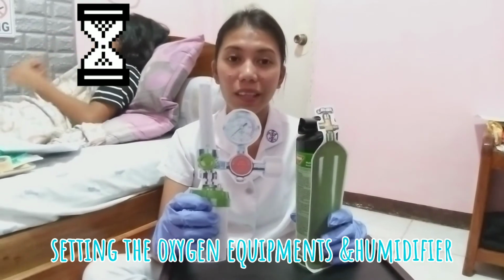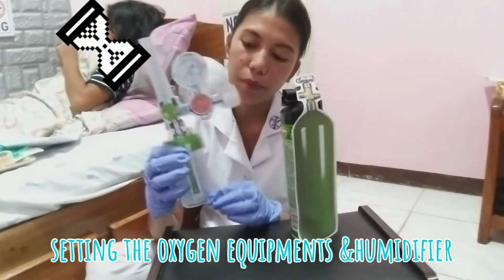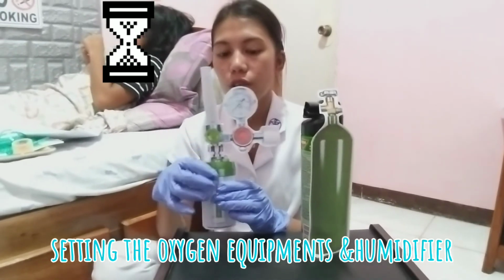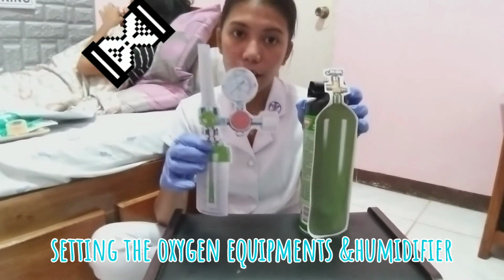Next is setting up the oxygen equipment and the humidifier. So this is our humidifier attached to our flow meter. Now we are going to connect the flow meter to our oxygen tank. I have already attached the flow meter to the oxygen tank. The flow meter should be in the off position.